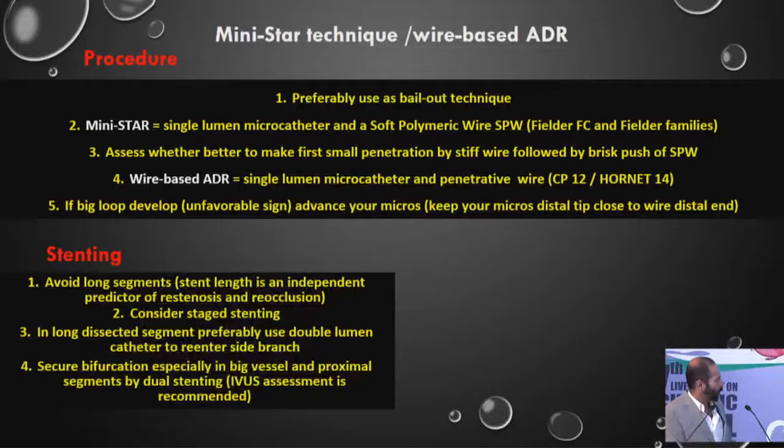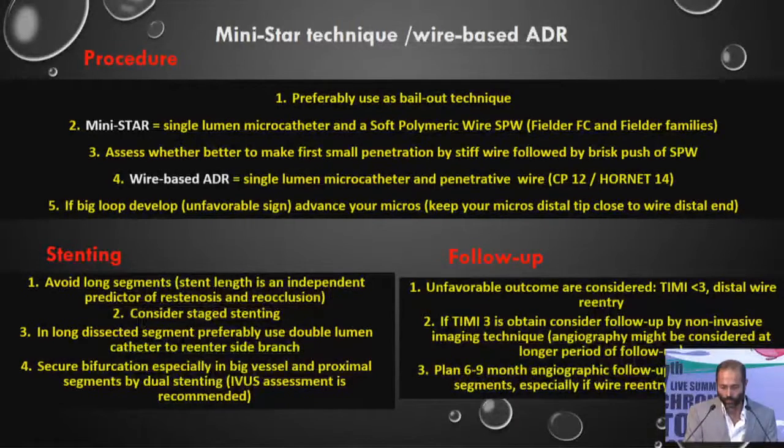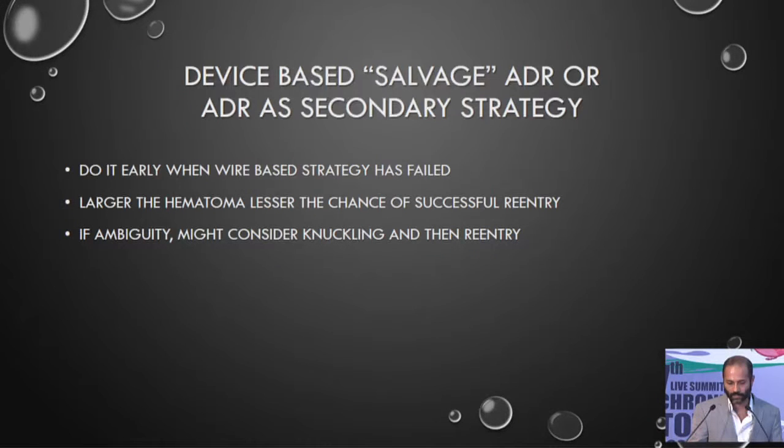And if you do have a bifurcation and you still want to stent it, like I said, imaging I think is critical, important. You really don't want to do it otherwise. The reason not to stent it, like I said, is you don't have good long-term outcomes. So I'm going to skip that. I have 3 more minutes.